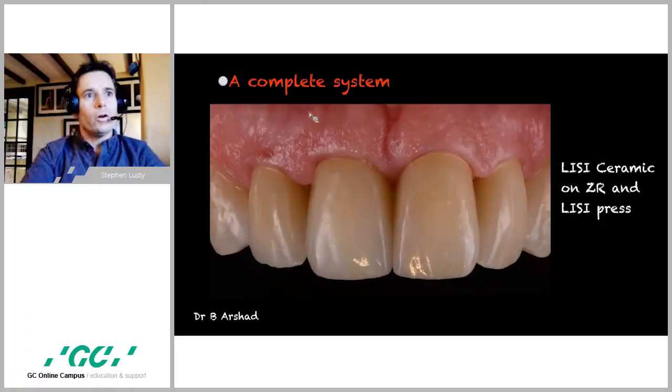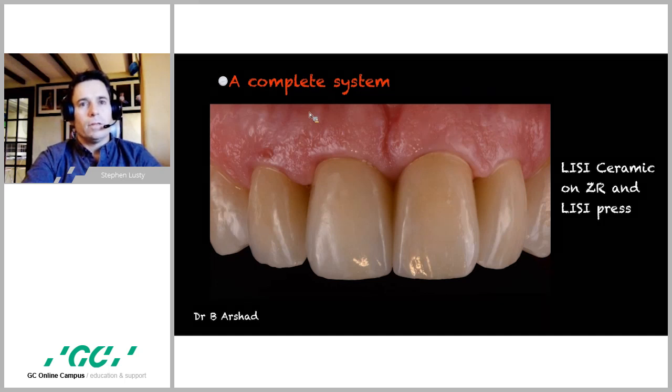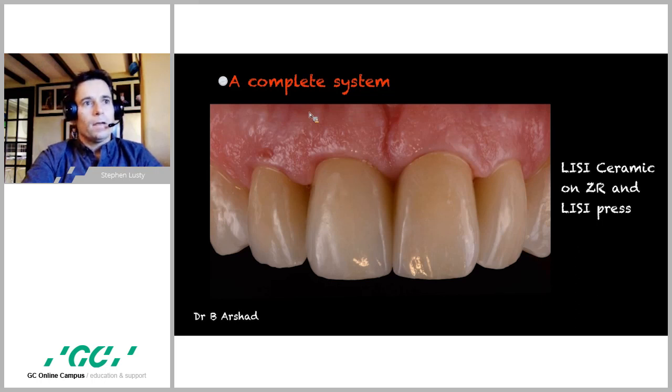So of course, we don't only use LiSi for single centrals or small cases. Sometimes we need to use it in combination with other materials, and it is really important that the mix of materials still looks to be a unity. Most commonly these days, I use it alongside zirconia units. When I do, if the zirconia units are singles or small bridges with minimal layering, I will simply layer both the LiSi press and the zirconia with LiSi ceramic and fire them together. I have no issue with doing this, and both the LiSi press and the zirconia will use a bonding layer of luster paste, so we're working from the same stable base.